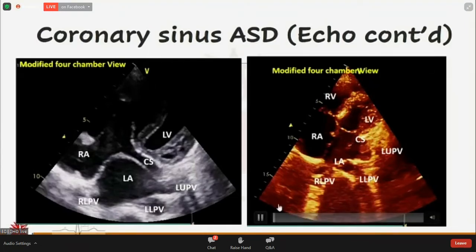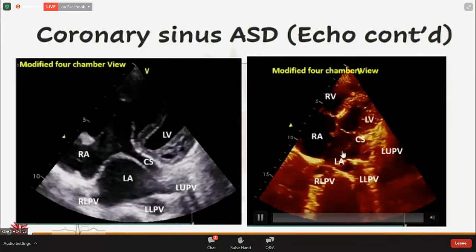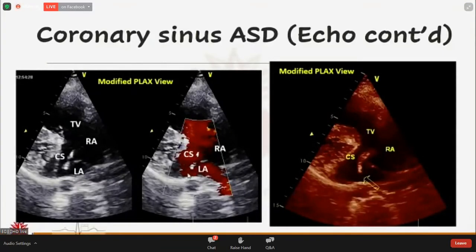Fortunately, I found my answer. There is a communication between the coronary sinus and the left atrium. There is another finding: the left-sided upper pulmonary vein is draining into the coronary sinus rather than the left atrium. There is a left-to-right shunt between the left atrium and the coronary sinus.